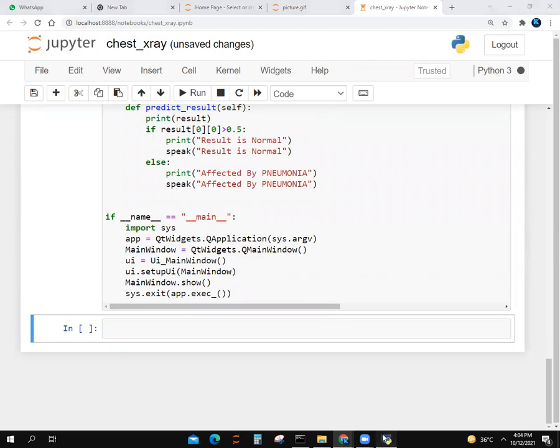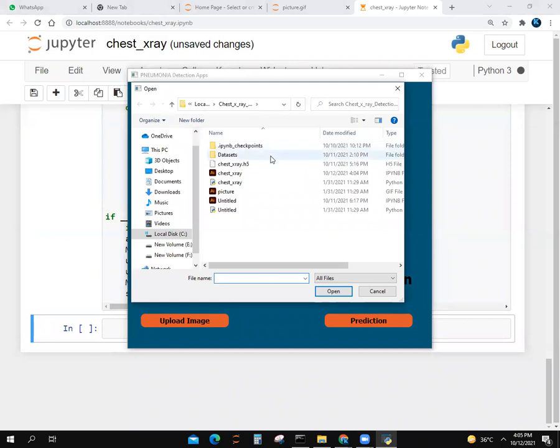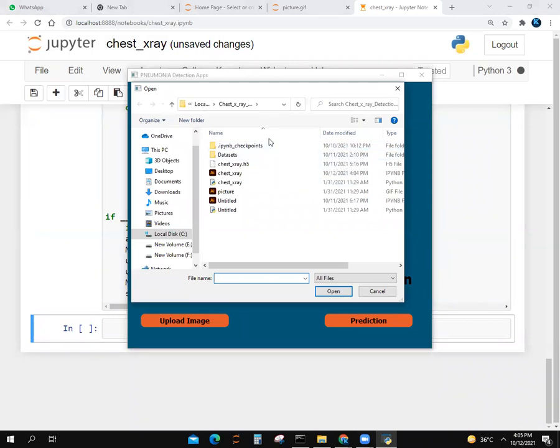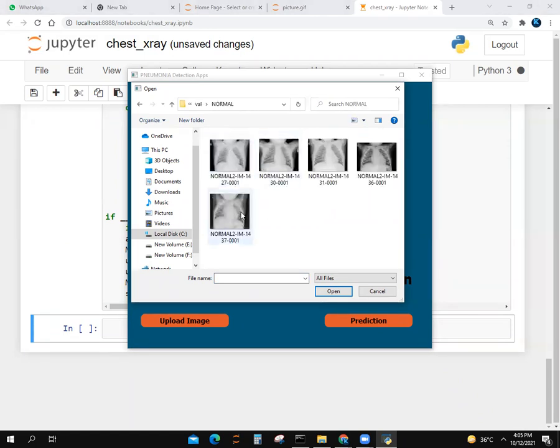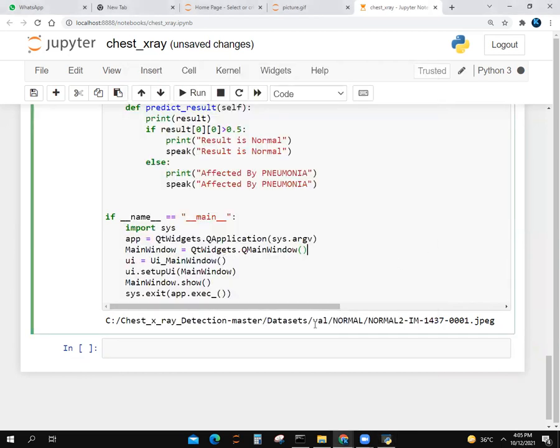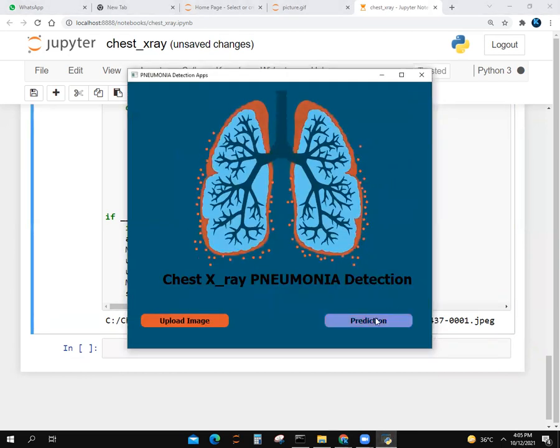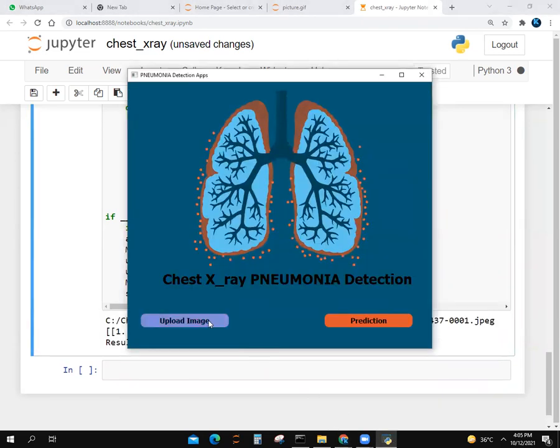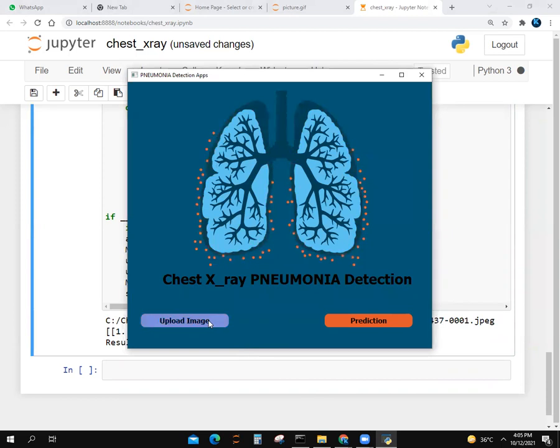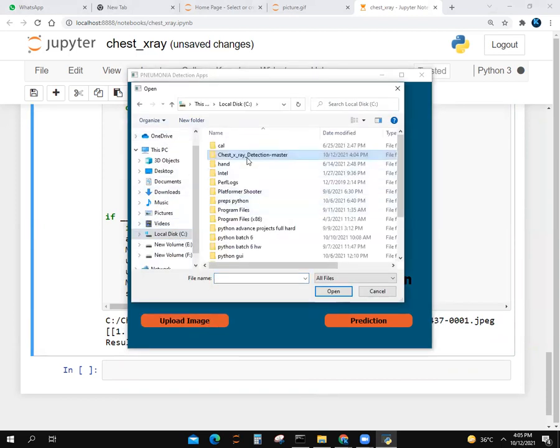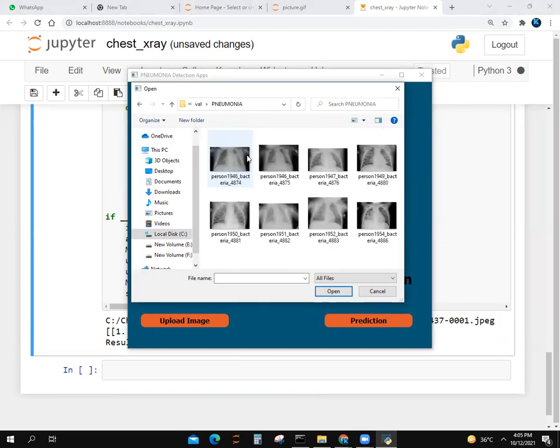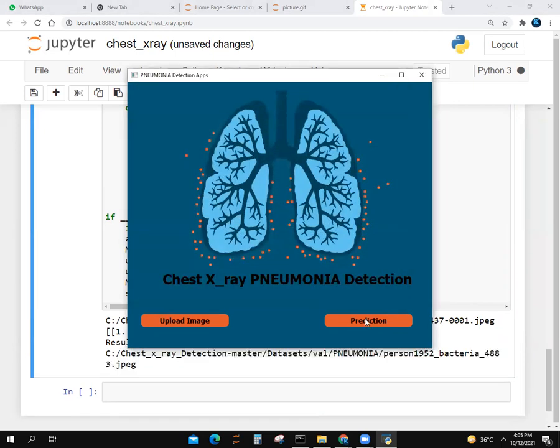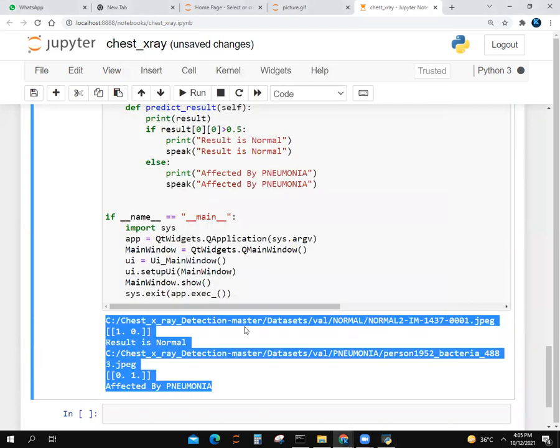Look, the window is open. There is no error. We will upload an image. Let's go to dataset, validation, normal. Let's give this and do prediction. Here we go. Result is normal. We took the image from the normal folder. Let's go to chest x-ray dataset, validation, pneumonia. Let's click on here. Prediction. Affected by pneumonia.